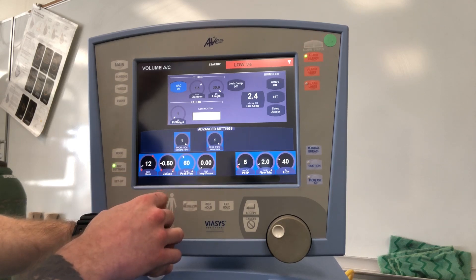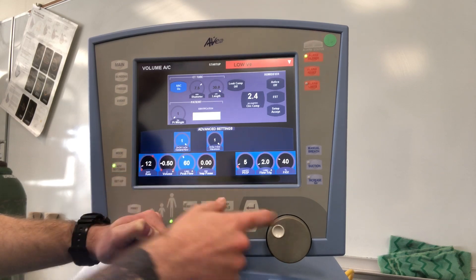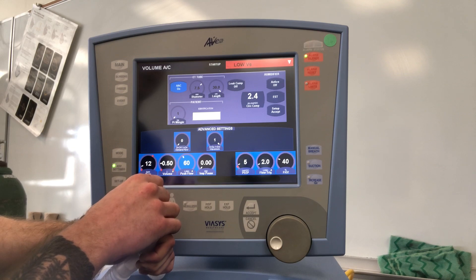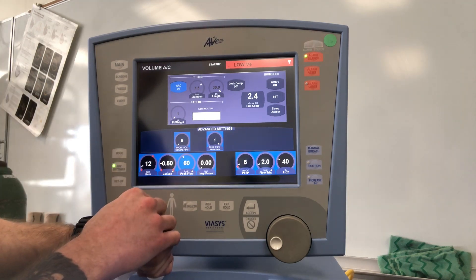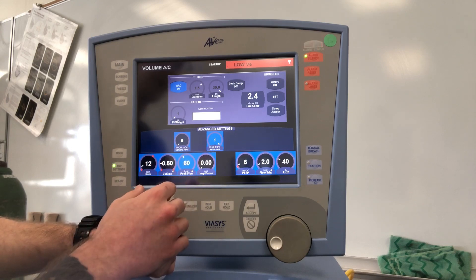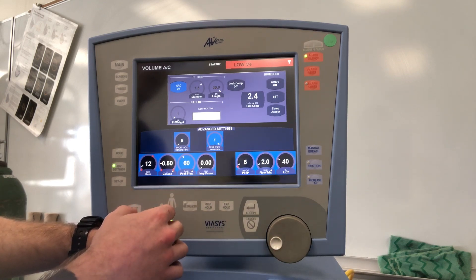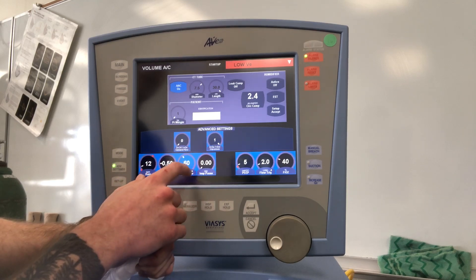Under peak flow, there's the option of demand flow. We recommend turning demand flow off, especially in volume AC for ARDS patients, because it can allow them to take in volumes we have not set. You also have the option of a square or decelerating waveform, which will adjust your I-time. Personally, a decelerating waveform is preferred — square flow waveforms have their place, but decelerating is generally more comfortable.